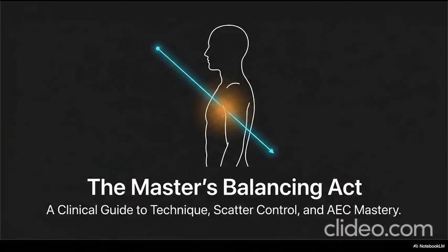Oh, so the resulting image would just be a flat, muddy gray smudge. Precisely. You lose the brilliant whites of the bones and the deep blacks of the air. You lose the diagnostic value entirely because the differential absorption, the very thing that creates the shadows we call an X-ray image, is wiped out by overwhelming force. I see. So you can't cheat the physics by maxing out the power.